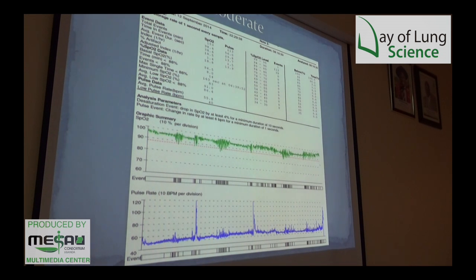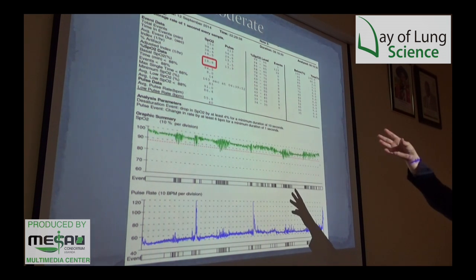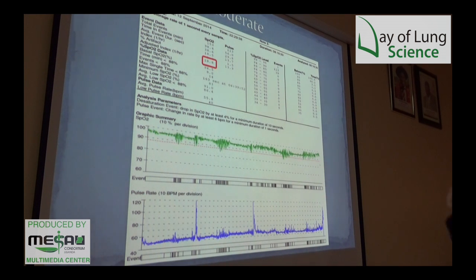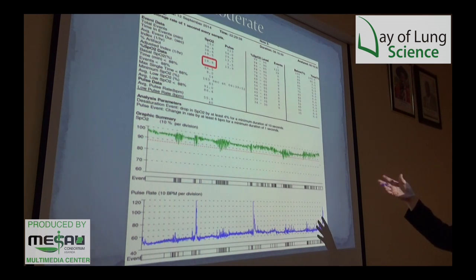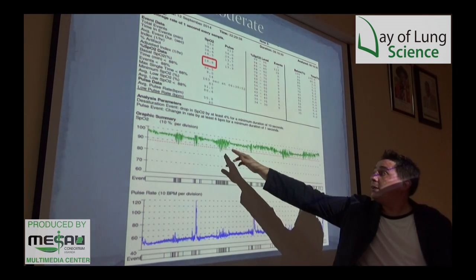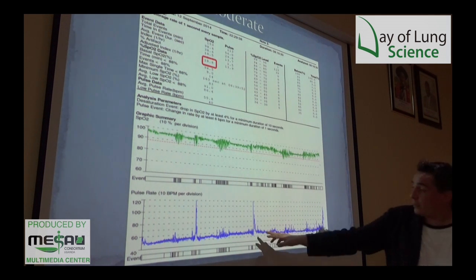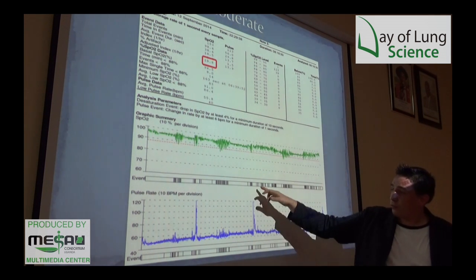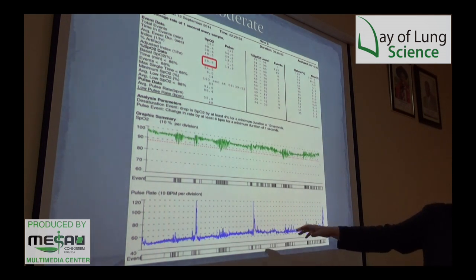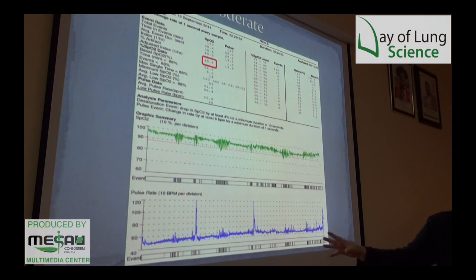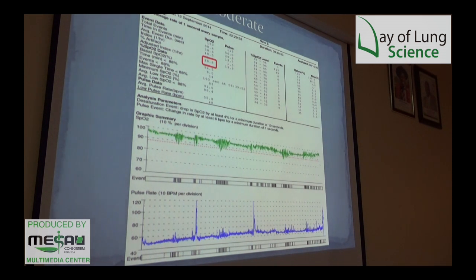Moderate sleep apnea: the index here is 18. The scale is: less than 5 is normal, 5 to 15 is mild, and 15 to 30 is moderate. You can see more extensive periods of desaturation, with pulse rates going up to 120 — a lot of stress on the cardiovascular system.